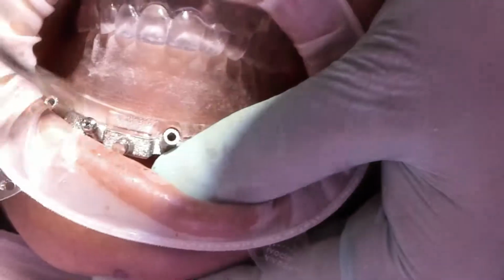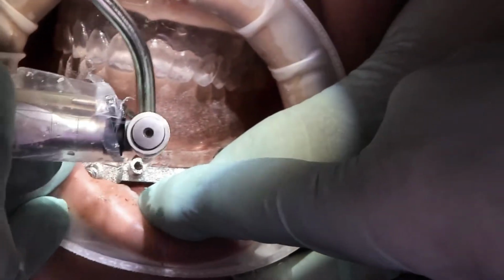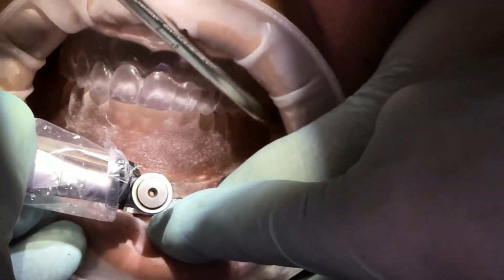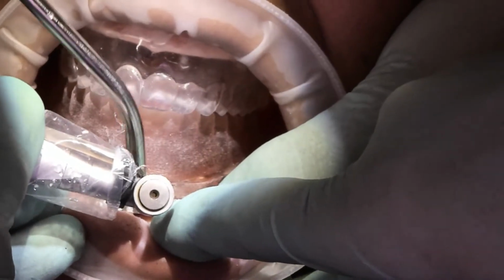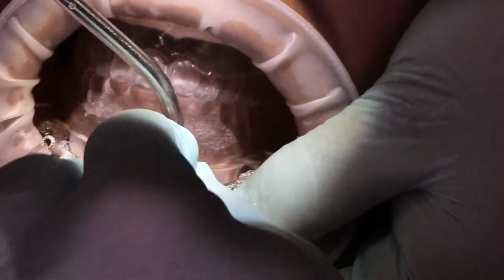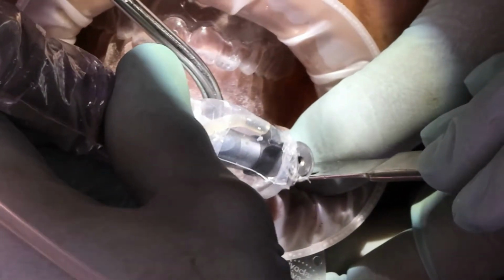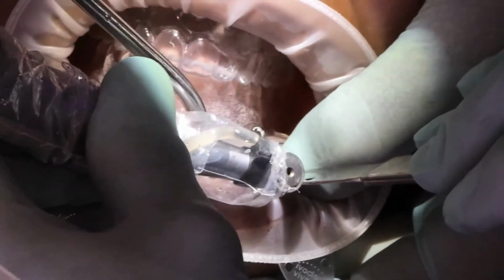Then they are removed from the mouth and they are assembled with the fixation bases. And with both assemblies, they are reinserted back into the mouth, and the patient's mandible and head are held together while the sites are drilled. Drill all the sites, mandibular and maxilla, and place pins in one at a time.